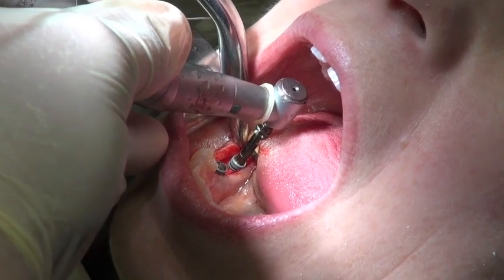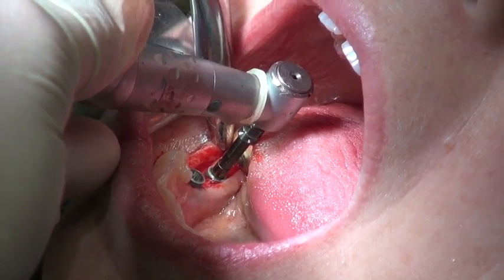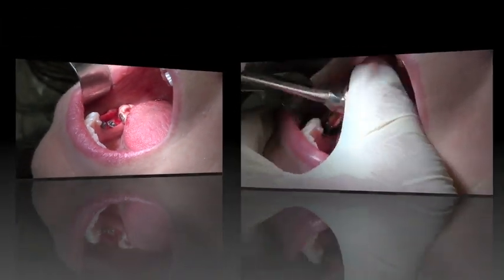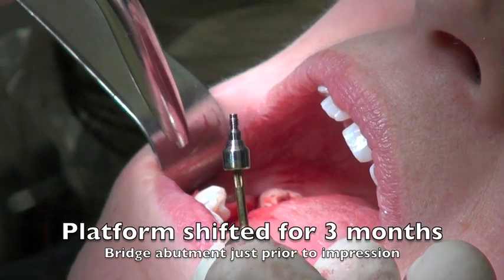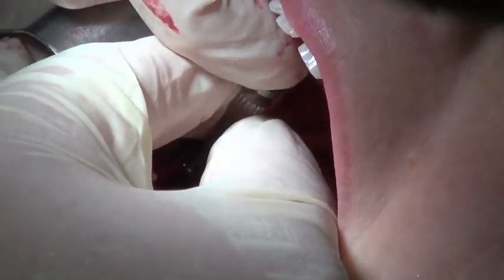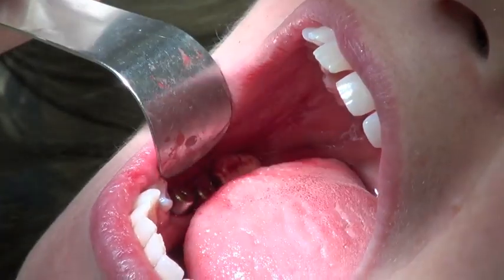The cortical bone on either side of the implant is squeezing in the ridge, so the posterior implant goes in quite nicely right down to the ridge height, but we need to apply a little extra torque on this implant. I've chosen a staged healing approach, so I'm using a platform shifted type of healing abutment placed intentionally so soft tissues can heal around the top of the implant as much as possible during this first healing phase. Then I'll switch to bridge healing abutments later, which are non-platform shifted.